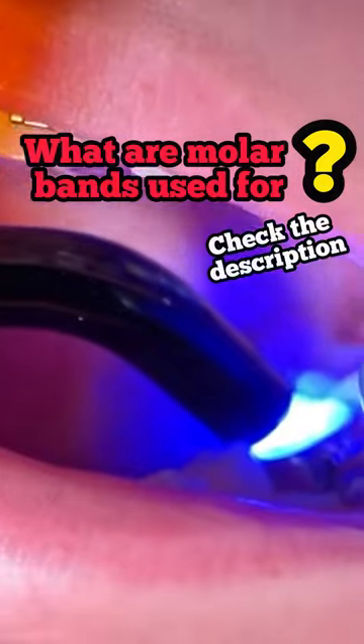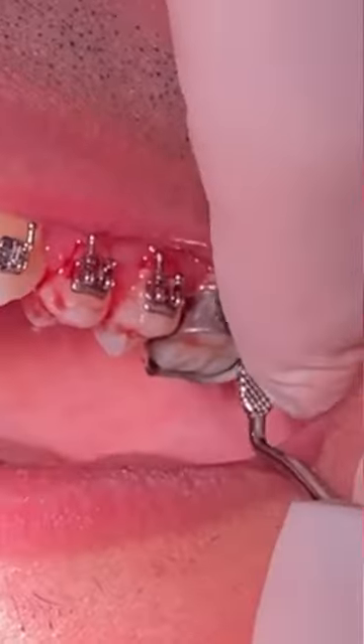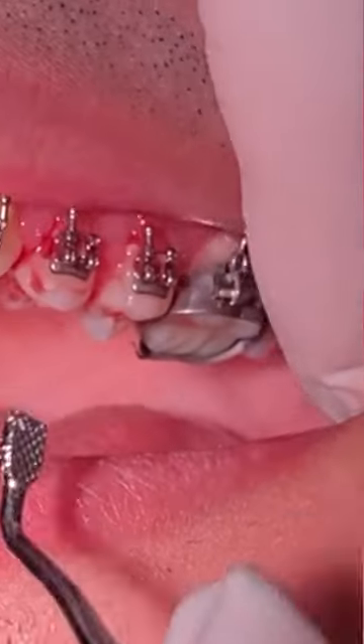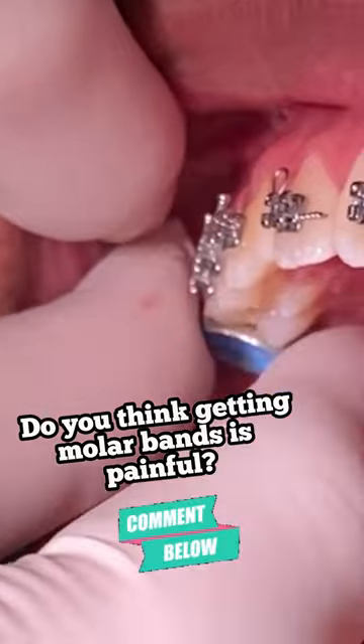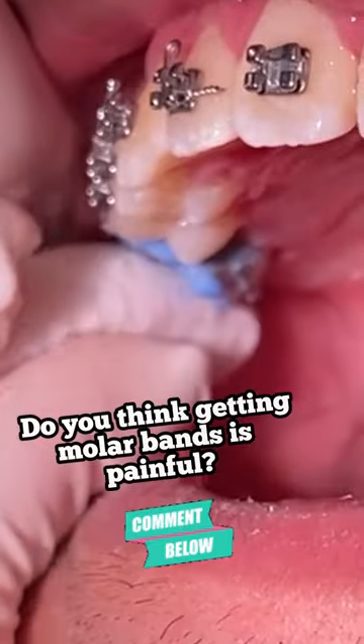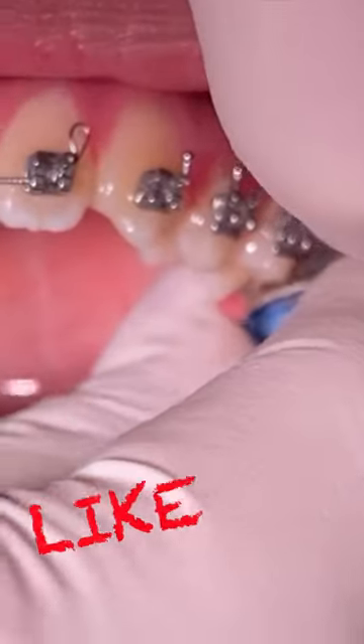Molar bands are used to extend the wires to the back, assisting in aligning and rotating the correct bite of the teeth. Some of you may wonder if this hurts — honestly, if you already had your braces put on and you're having these molar bands placed, you've gone through the hardest part.